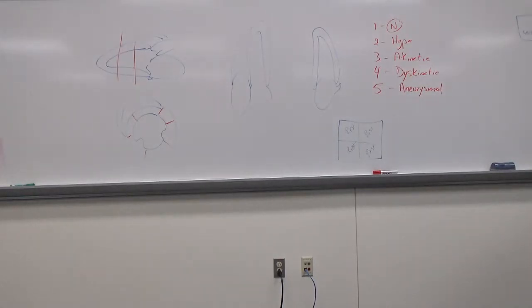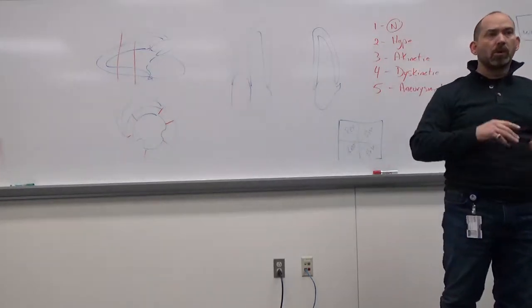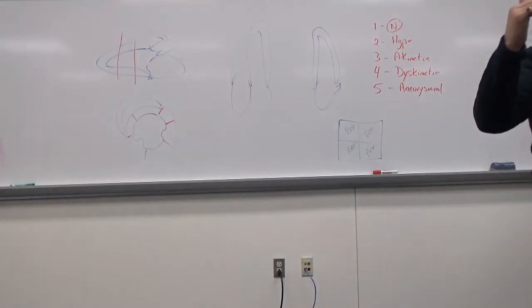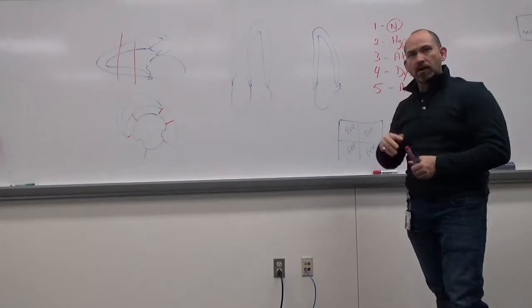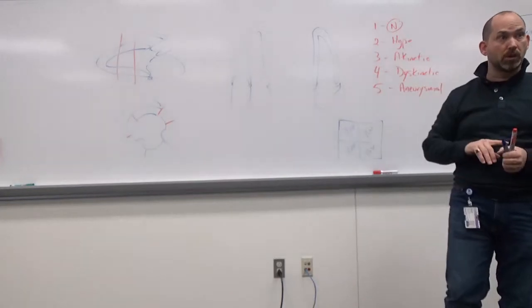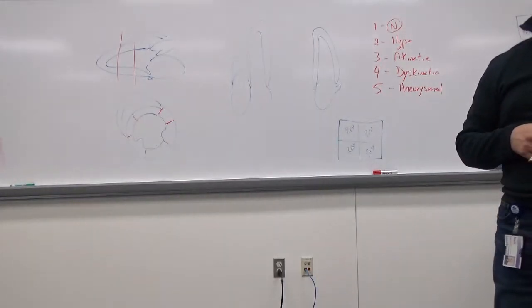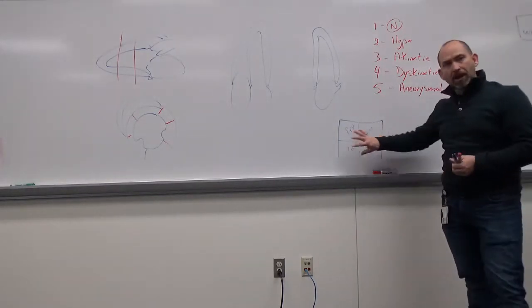When we do a dobutamine stress echo or pharmacological one, or an inclined bicycle one, I'm going to do resting, I'm going to do a peak, so the maximum workout, and then we do post-recovery images as well to see this has gone back to normal. So in that case, we'll do 3. But pharmacologically, we can do up to 7 of those on a stress package of a system. So just be familiar with how they're laid out.